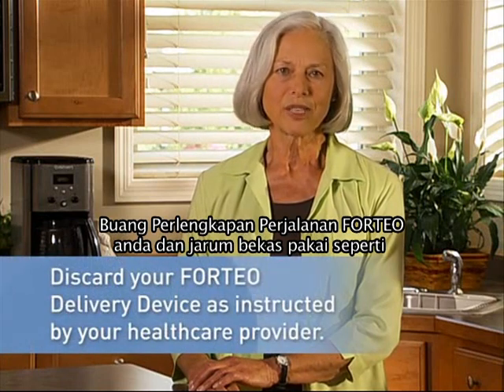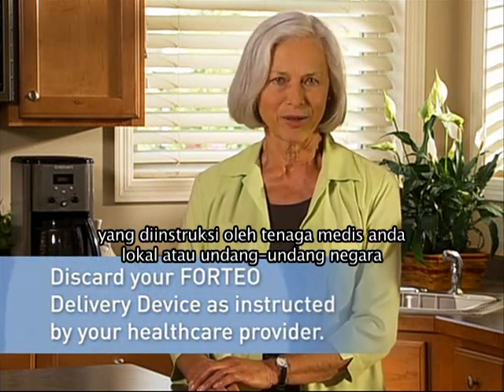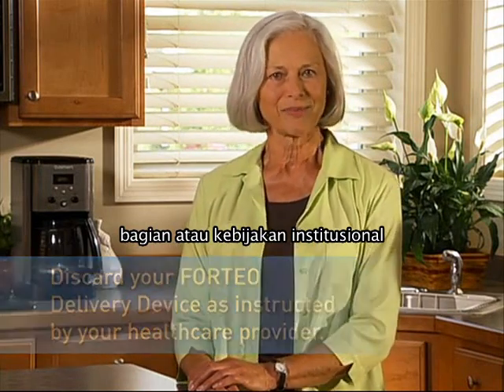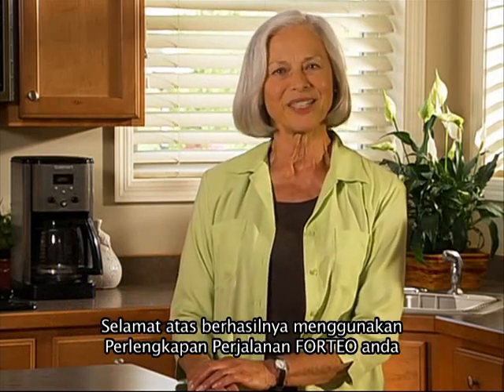Throw away your Forteo delivery device and used needles as instructed by your healthcare provider, local or state laws, or institutional policies. Congratulations on successfully using your Forteo delivery device.